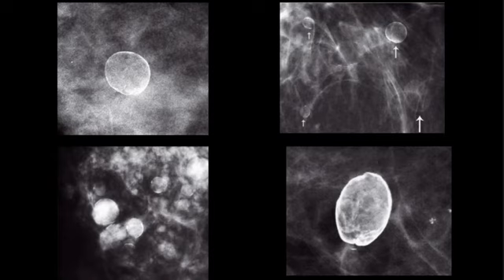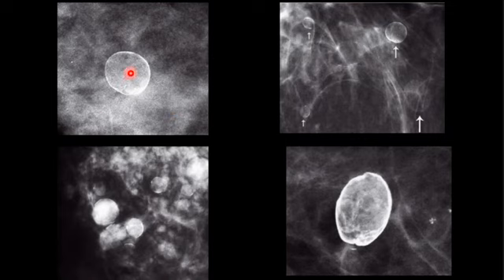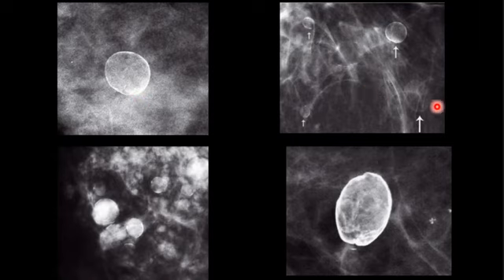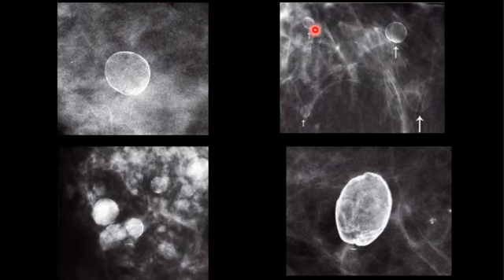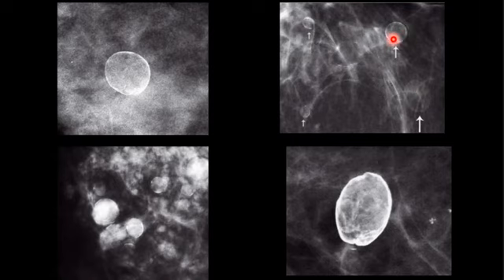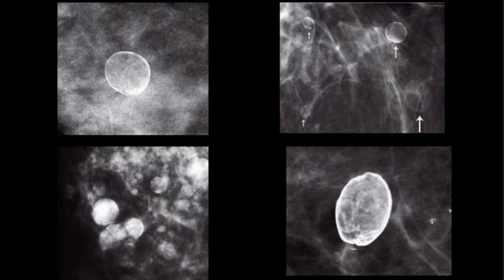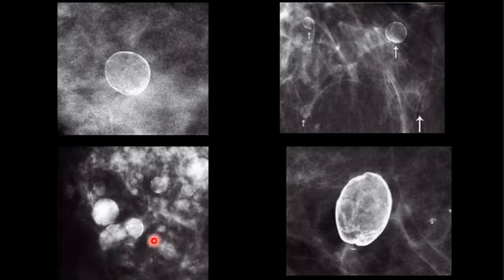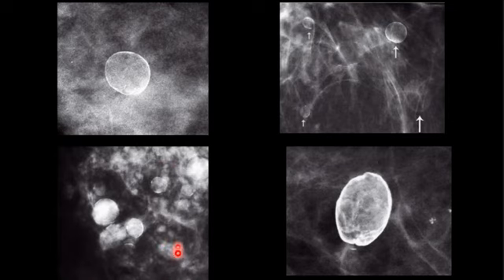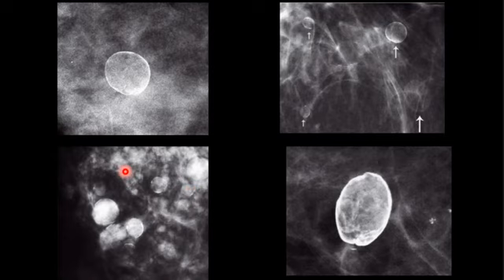For example, here is a calcification in a lucent center — you can see the center of this cyst is relatively lucent compared to the wall. In a different patient you can see different cysts of different sizes at different stages of wall calcification. In a third patient you can see rim calcification around several silicone granulomas — ill-defined mass-like lesions with calcified cysts developing between and around them. This is the old type of breast augmentation: injecting silicone directly into breast tissue without a containing capsule.